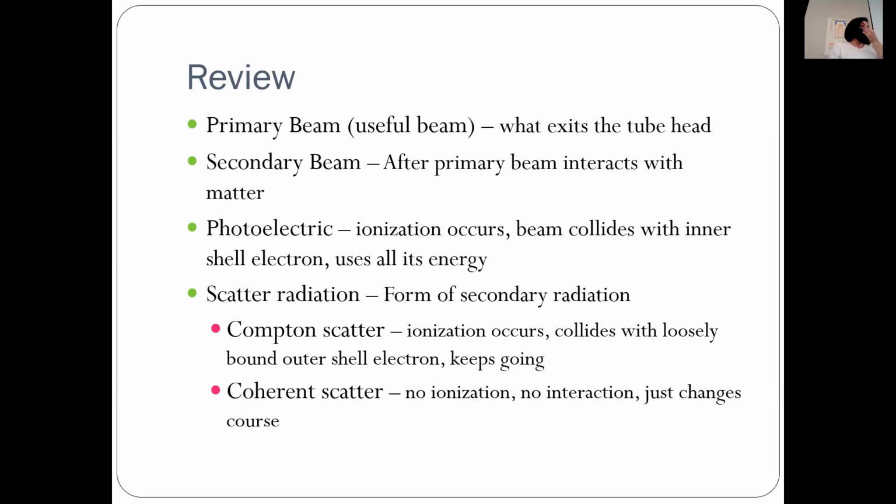Any questions on all that? With the scatter, when you say it just goes, where does it go? Do we know? Well, it keeps traveling. So if it does keep going and happens to make it to the sensor without having done anything, then it's going to give its full X-ray photon power to the sensor. It'll probably hit the sensor.